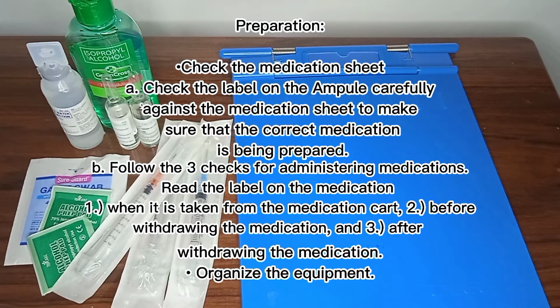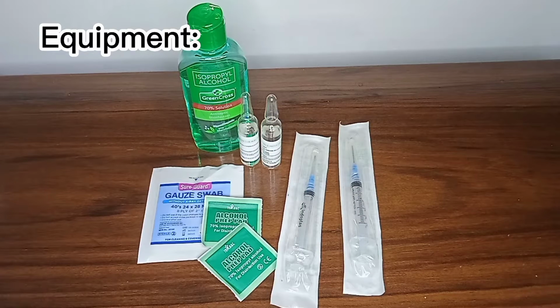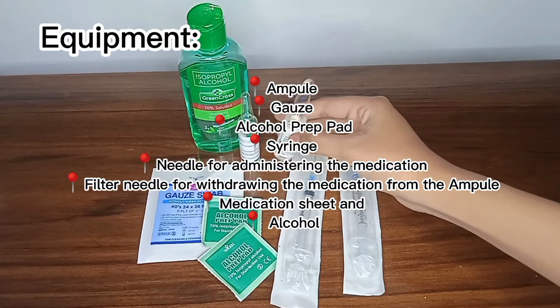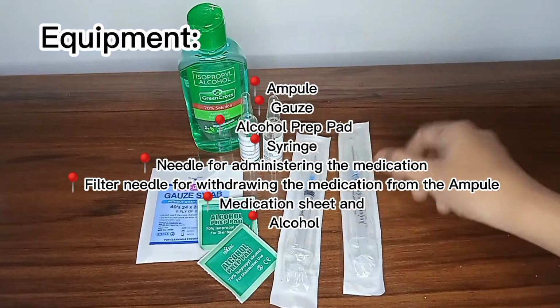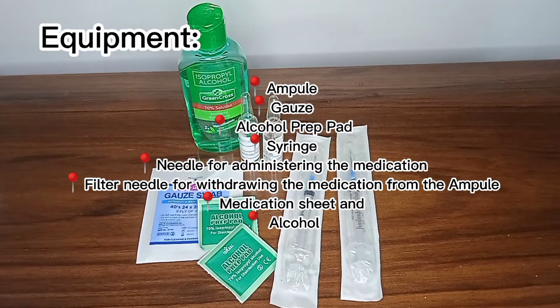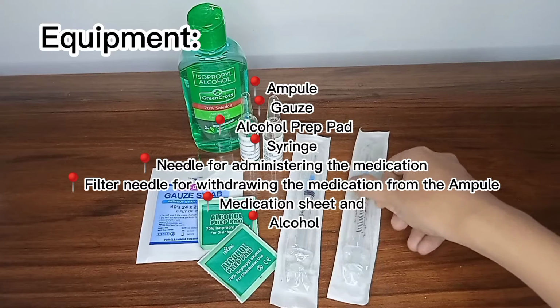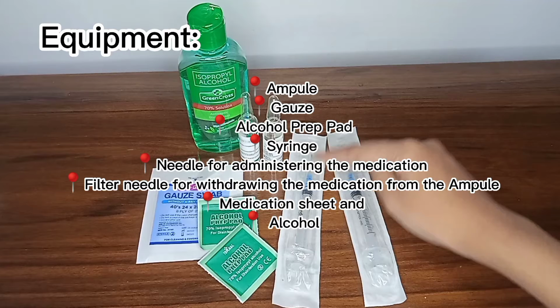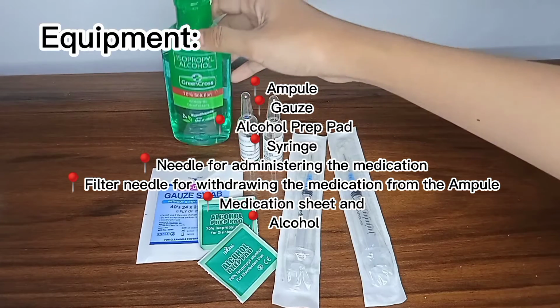Then, we must organize our equipment. In preparing medication from ampules, the equipment we'll be using are the following. Of course, ampules, gauze, alcohol prep, syringe, needle, filter needles, but since we don't have any available here in our community, I'll be using an extra syringe with needle, a medication sheet, and of course, alcohol to sanitize our hands.